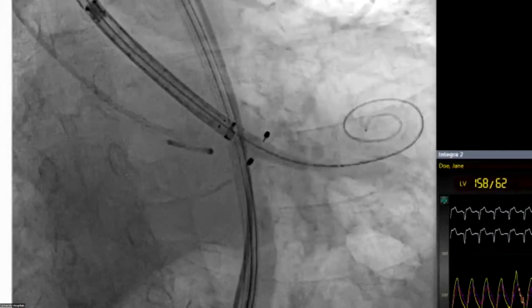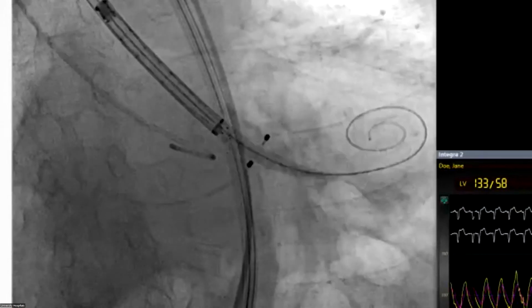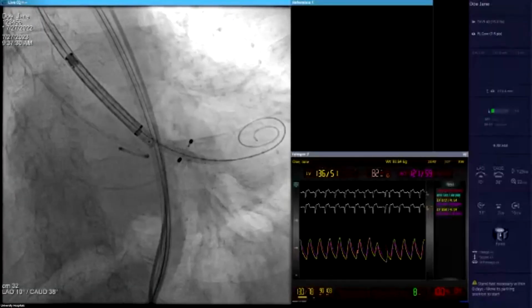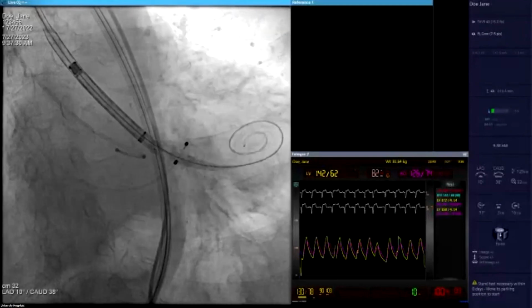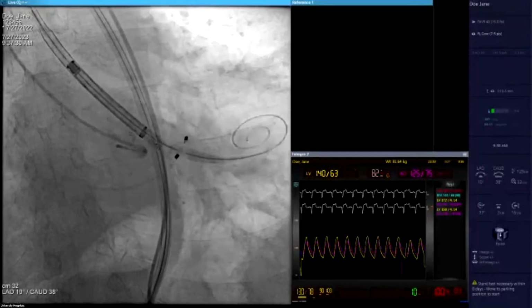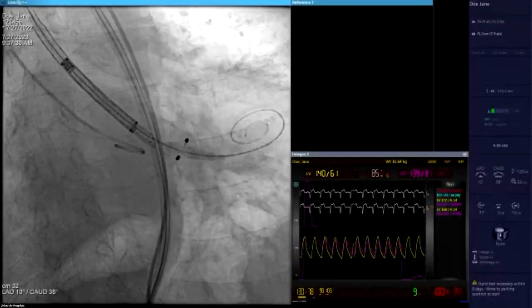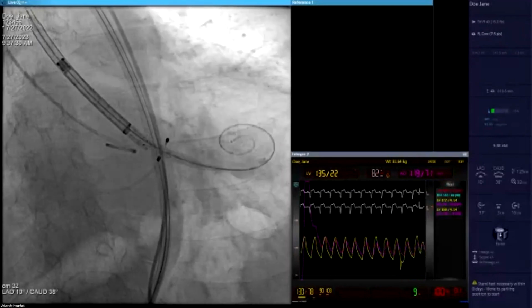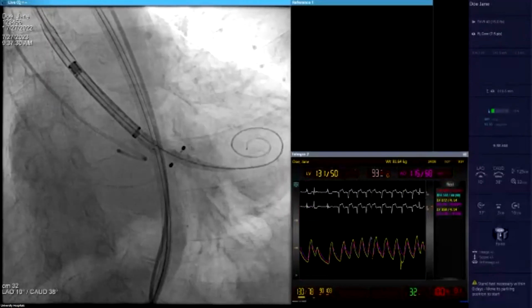Stay still there, darling, please. We're deploying the valve right now, okay? Stay very still. So you see, we're starting to come out. Do you usually pace at this point? Yeah, not at this point. We're gonna pace when we start to flower. Not yet. Puff. Okay. Puff. Good. The golden markers that you see in the bottom of the valve are located at 3 millimeters. So we want to be in the non around 5-ish, because we don't want to miss the left, as I mentioned. Puff.